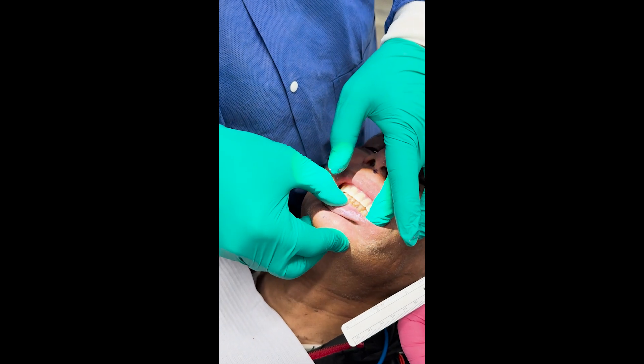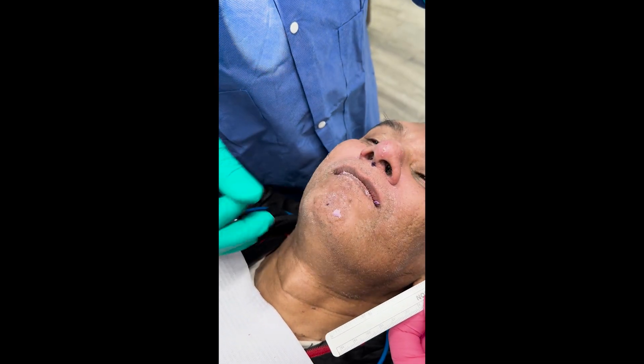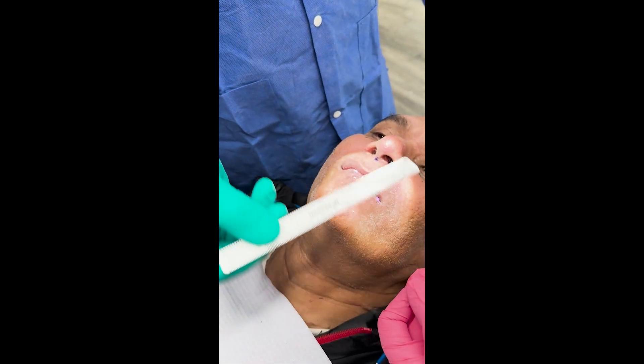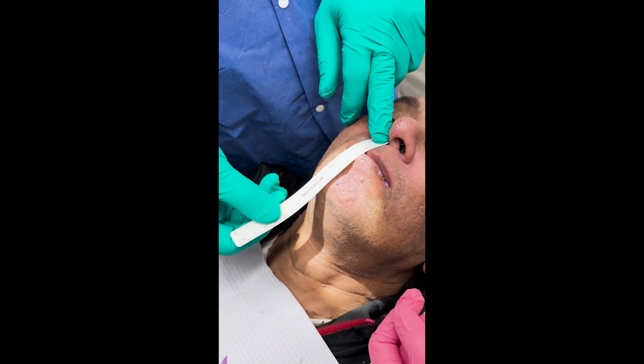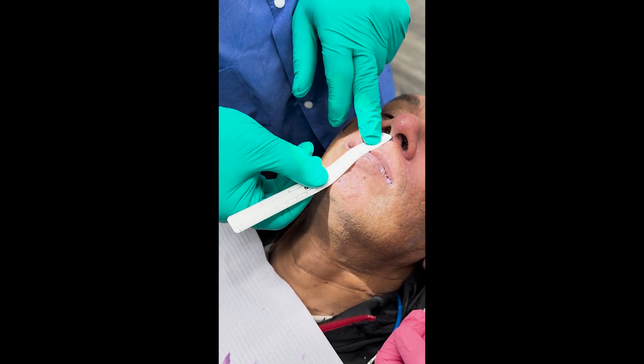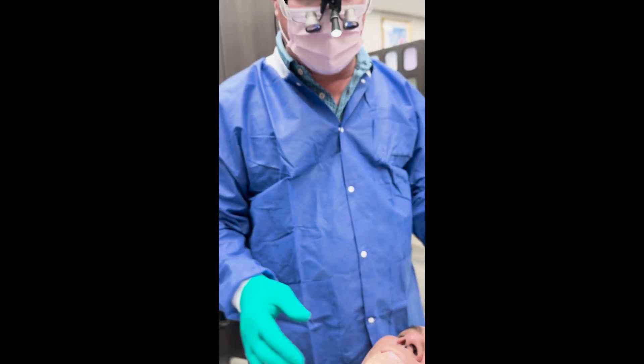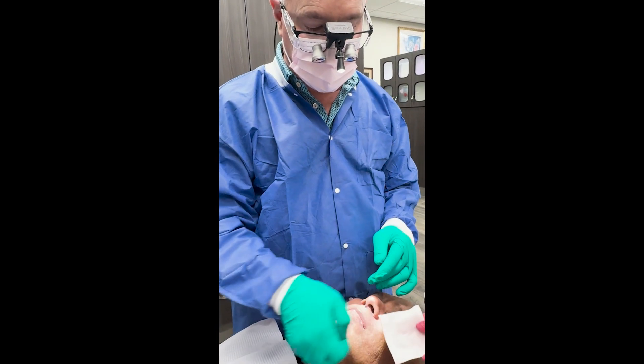Bite together. Does that feel okay? Now I'm going to measure again — exactly 60 millimeters. So my two cotton roll bite was right on. We don't have to change anything — we're just going to have the lab mount the case as is.